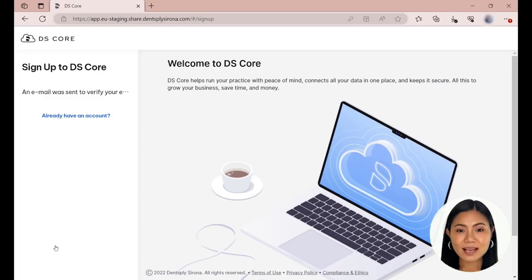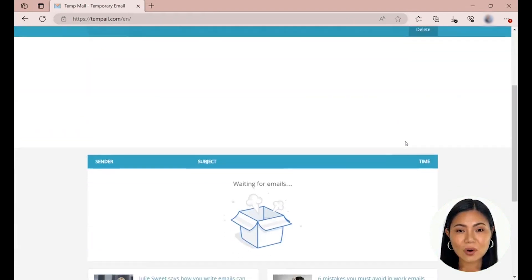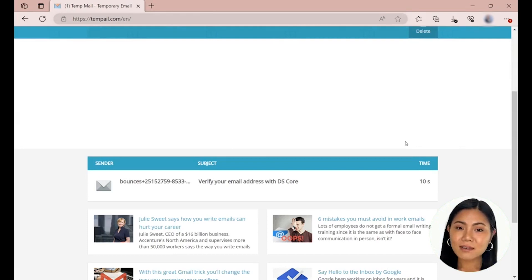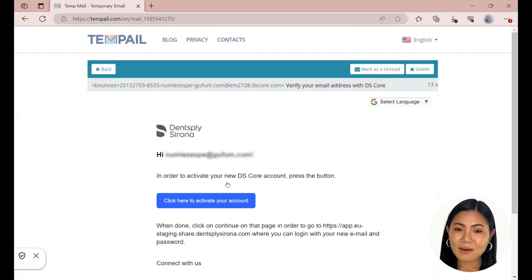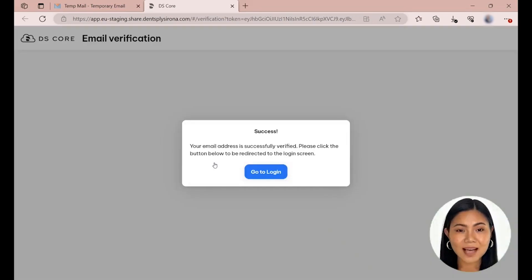A confirmation email will be sent to the email you provided. Go to your email account and open the email from DSCore with the subject line Verify your email address with DSCore. To verify your email address and activate your account, click on the blue button in the email. A new tab will open in your internet browser that will reload DSCore. Your account is now successfully verified. Click on the blue button to return to the login page.